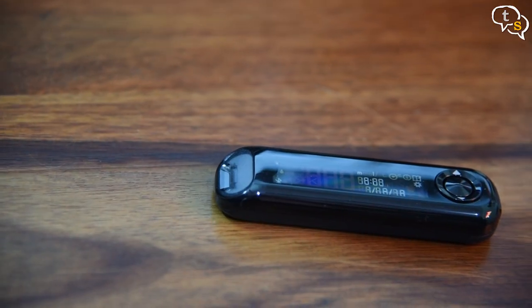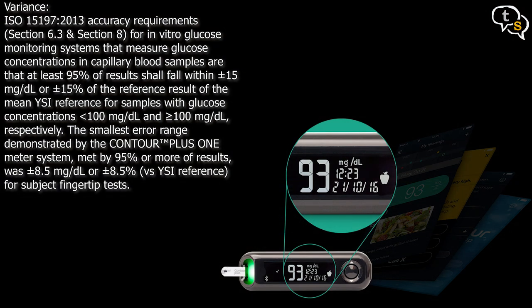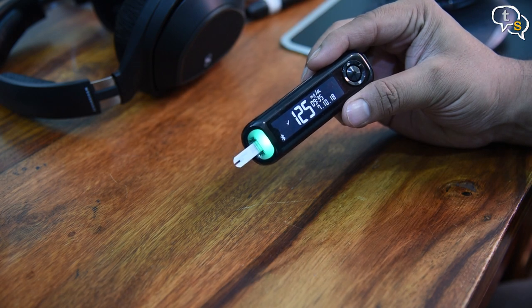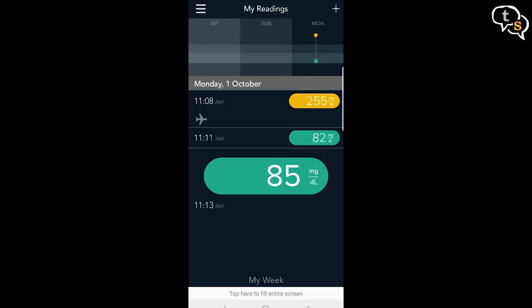This device has been touted as the most accurate among most glucometers available. The reading was almost similar to a lab test done a few days back. Personal glucometers for home use can have a plus or minus 15 mg per deciliter variance. The left side of the device, where the test strips are inserted, glows certain colors as per the reading — green means sugar level is within target, amber is above target, and red is below target. The app instantly syncs the data from the device and displays it on the phone.